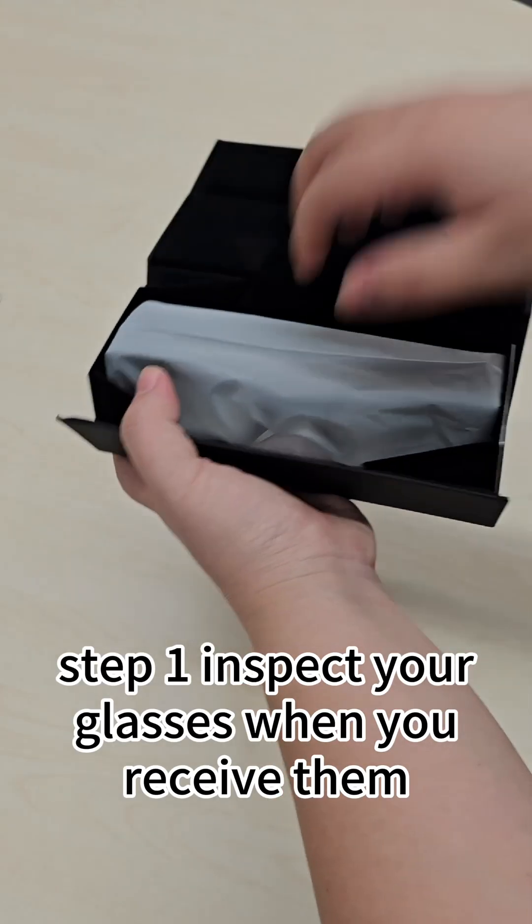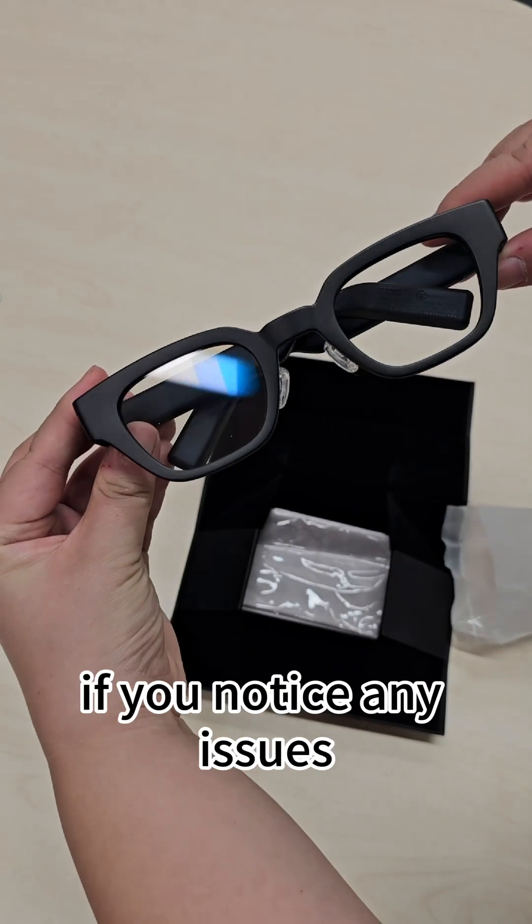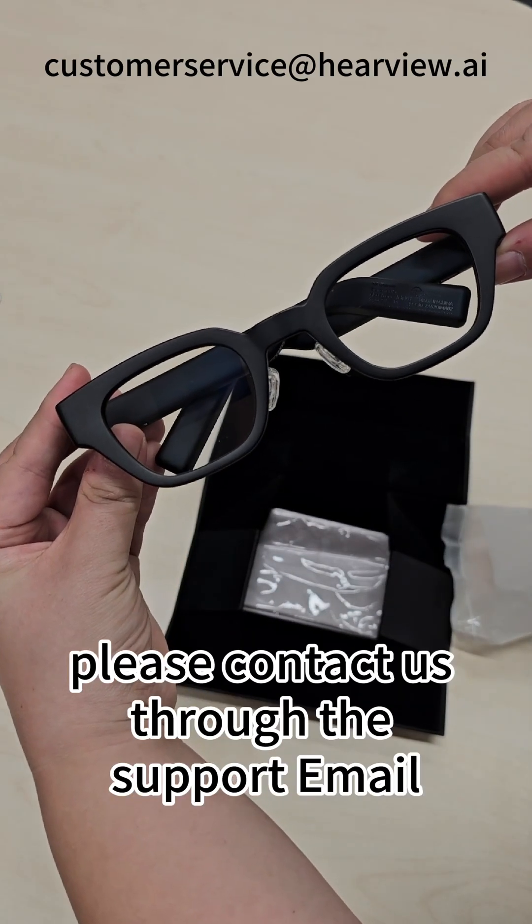Step 1: Inspect your glasses when you receive them. Please inspect them carefully. If you notice any issues, please contact us through the support email.